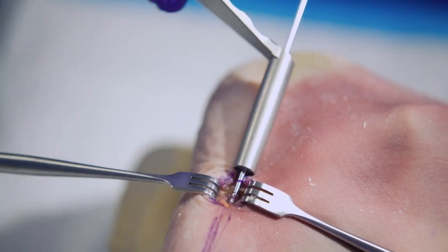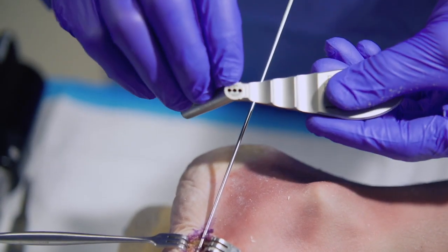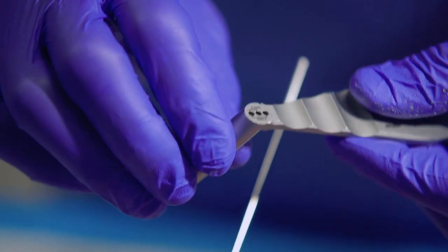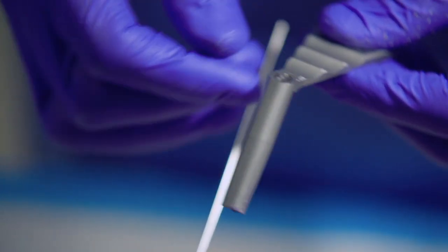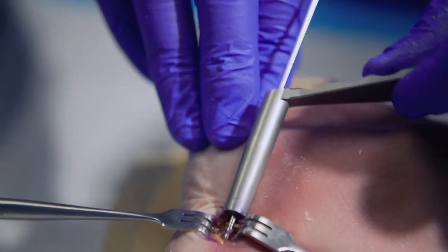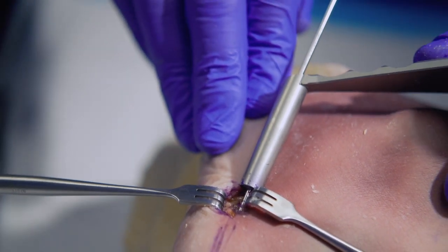One nice feature of the Asness Jones Fracture System is this parallel positioning guide or drill guide. There are three slots on the drill guide, two and a half millimeters apart from one another. That allows you to rotate the guide both in the sagittal and the transverse plane. So if your first wire is close, you can still utilize that wire and then rotate appropriately to push the wire medially, laterally, dorsally, or plantarly.